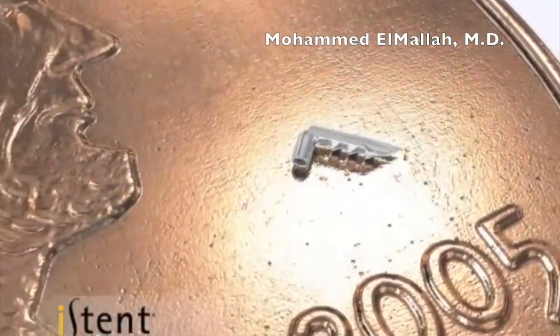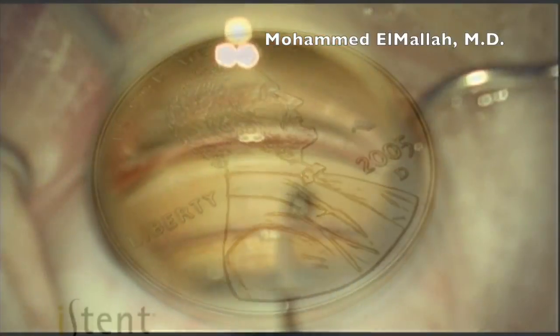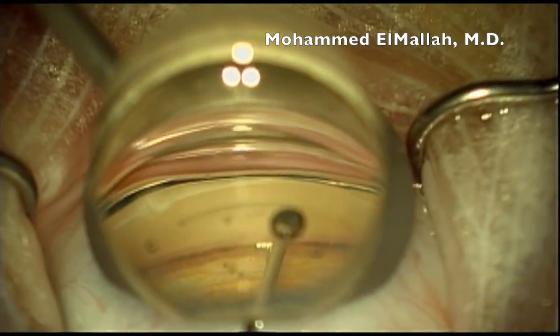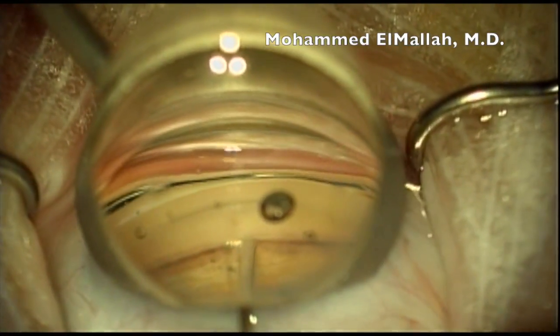The iStent, or trabecular micro-bypass device, is the smallest medical device implanted in the human body. I present several cases here of iStent implantation done in conjunction with cataract surgery.